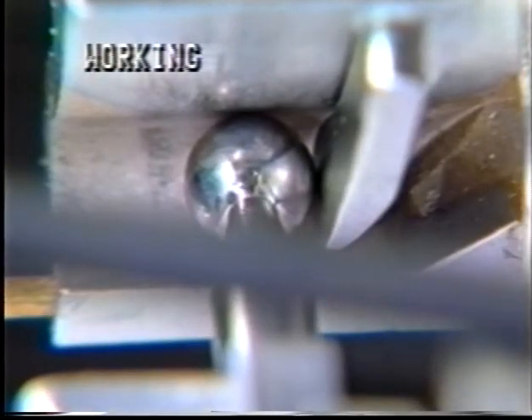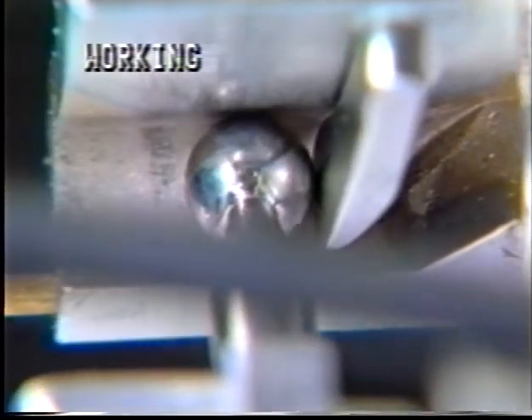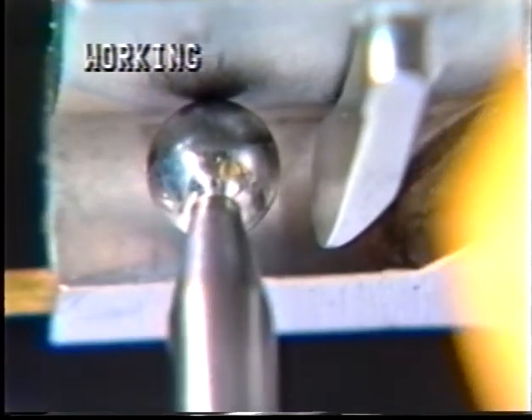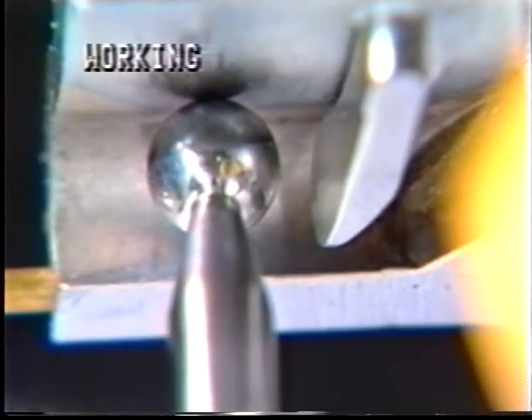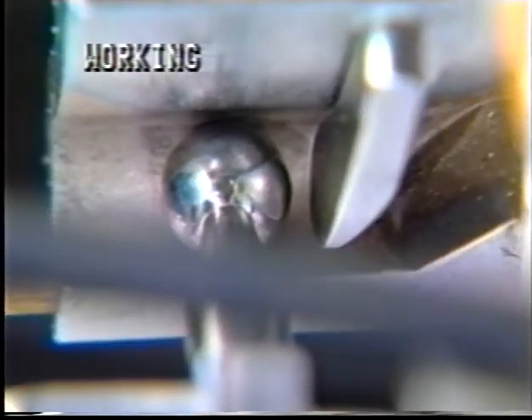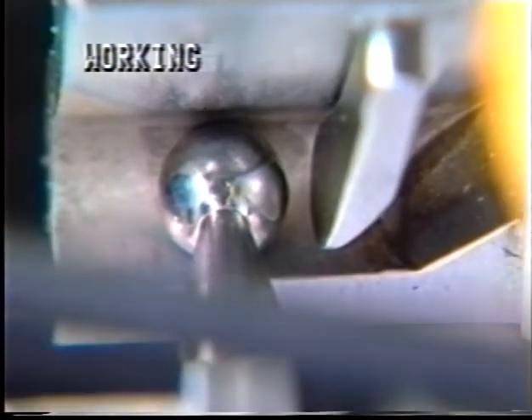We are now looking up at the right working side condylar sphere of the articulator mounted in the replicator, while our subject with severely worn teeth is chewing. Again, we see the effect of the looseness of the joint, which also affects contacts on the occlusal surfaces of the teeth.